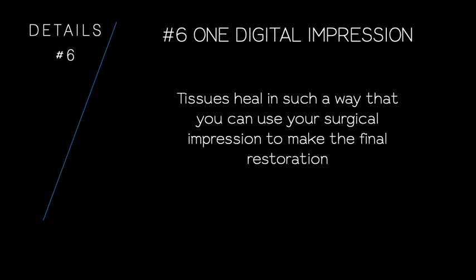in most of my cases, I wouldn't say all of them, but 90% plus, and most of my cases are being done like this, is that I've come to understand that tissues heal in such a way that you can use your surgical impression to make the final restorations.